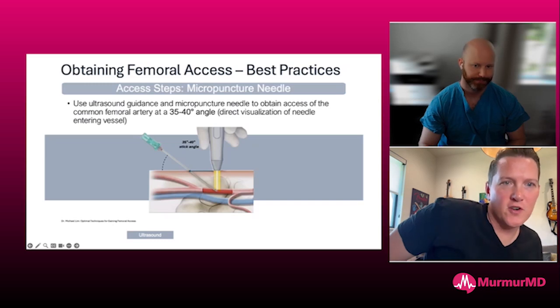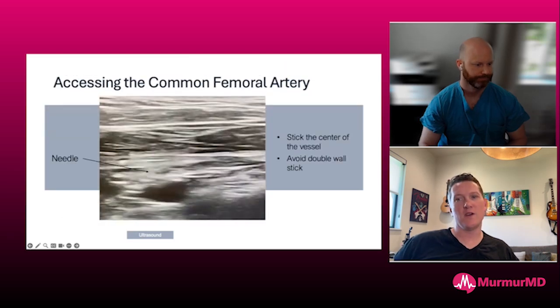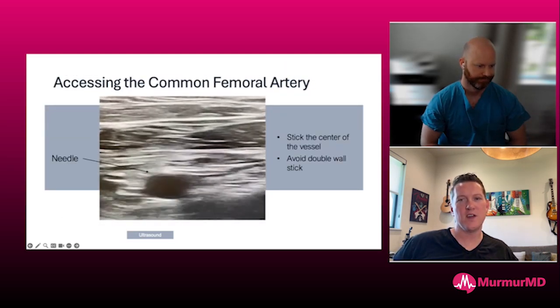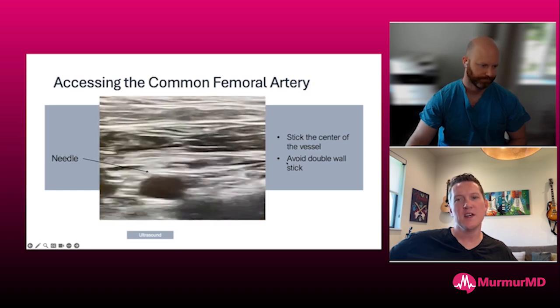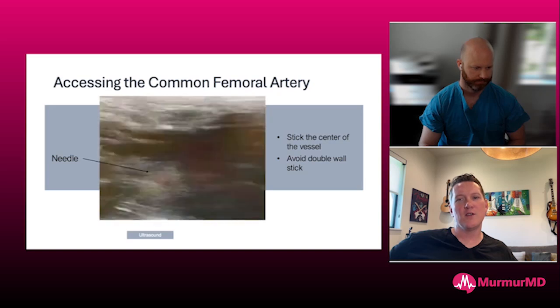Very surgical of you, Chris. But yeah, I think that the key point with ultrasound, and it took me years to get really good at ultrasound, is to see that needle going in. If you don't see the needle tenting the top of the artery, just like in this video, you don't know where that needle entered. And if you just do this, your access complication rate is going to go to almost zero, because it's clean, you're at 12 o'clock, and you're going to get good closure if you have good access.